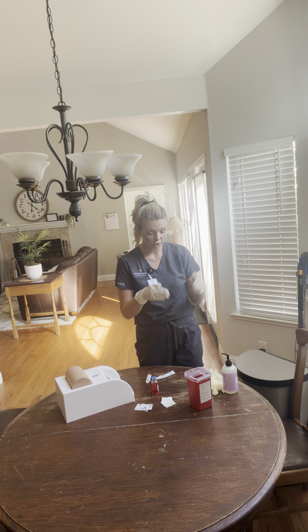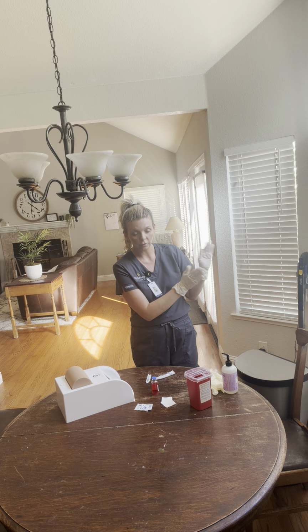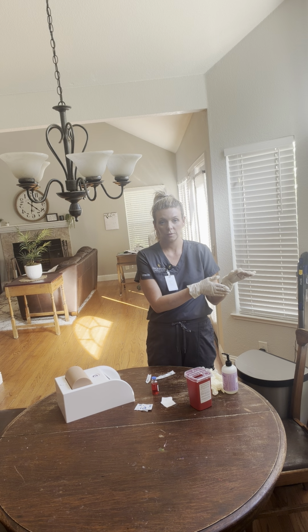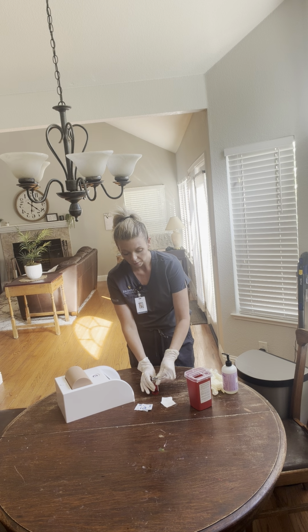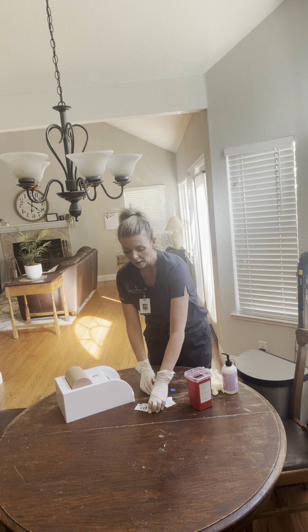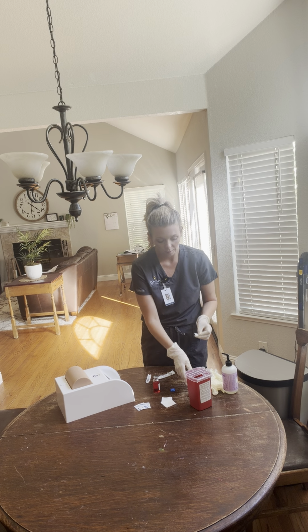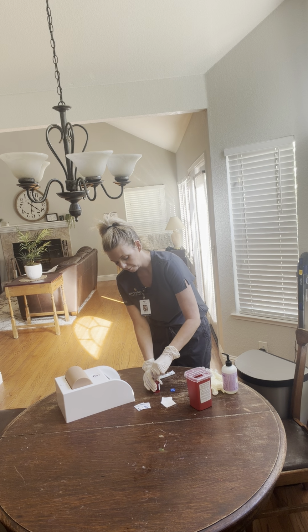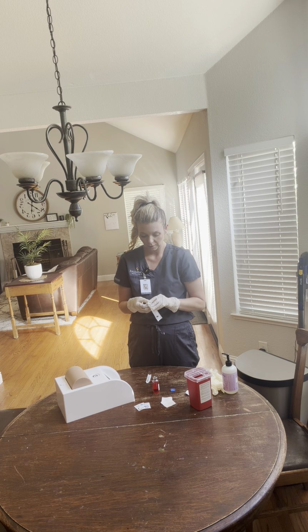So I've done my safety check. I've looked over the MAR to verify my provider's orders, and now I'm going to uncap my medication and verify it again with the MAR, and I'm going to get my alcohol swab, and I'm going to clean the top of my vial. This needs to air dry, so as it's air drying, I'm going to prepare my syringe and needle.